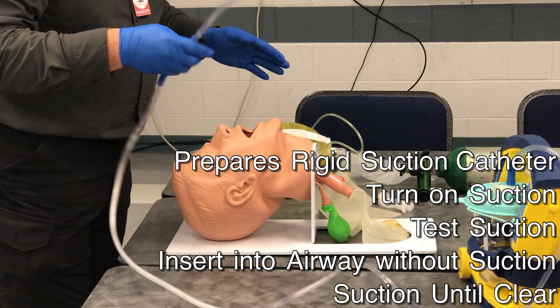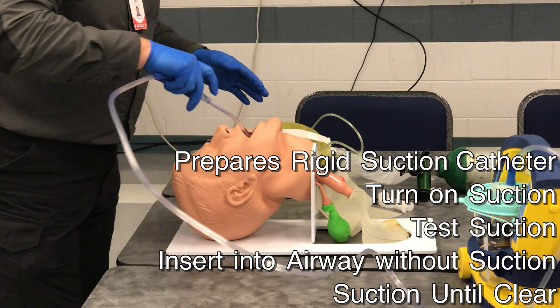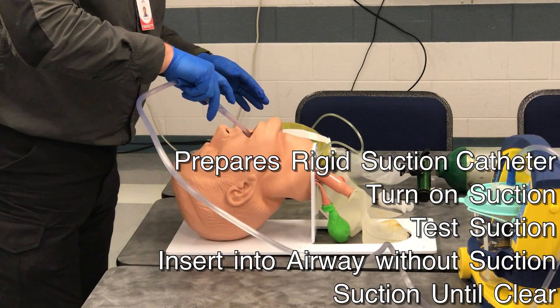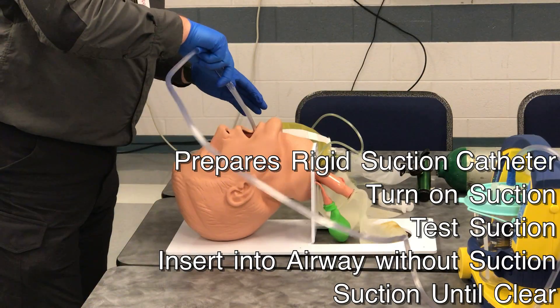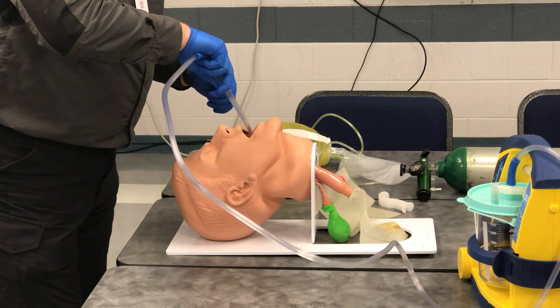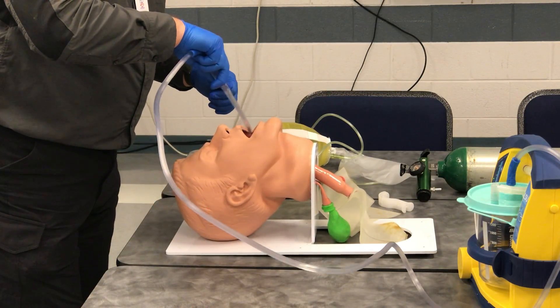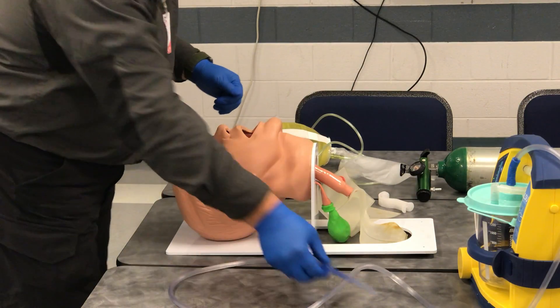Without the port being covered, I will insert it. I do not have suction at this time. Cover the port and begin suctioning the airway. I will suction for no more than 15 seconds and only suction what I can see. The airway is now clear.